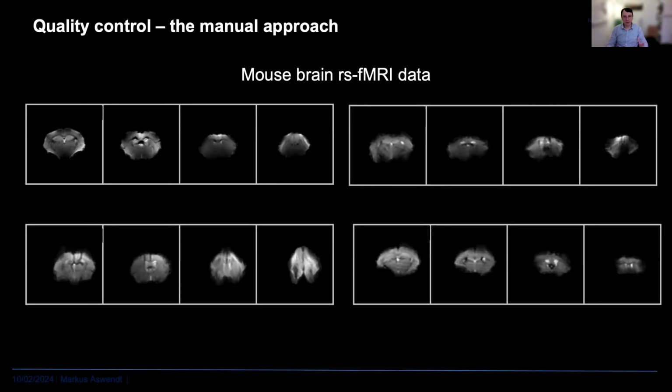Of course, this is complicated if you have not looked at this, and one will say, okay, I have not seen the complete data set, so far so good. But our automated pipeline in the end voted that these upper 2 examples are actually of good quality, so not an outlier. But this one here was labeled as an outlier. And you can now think for yourself if this was yours.